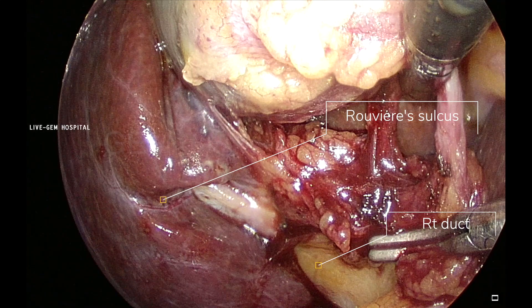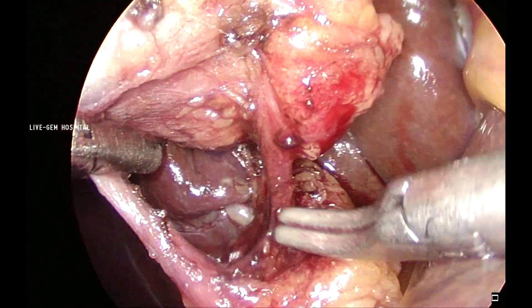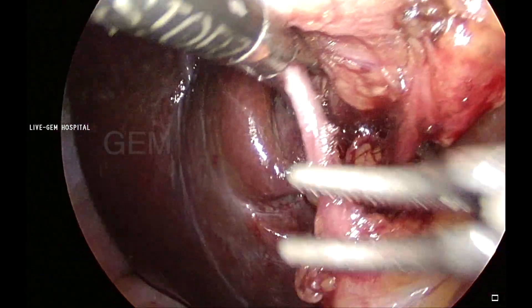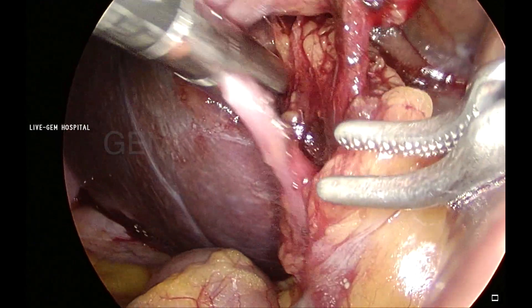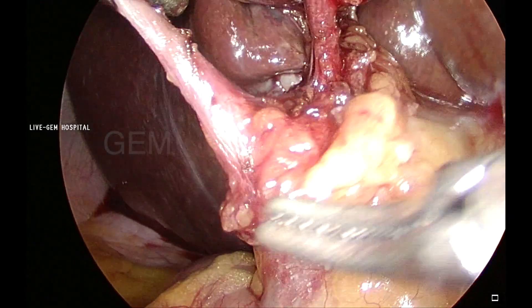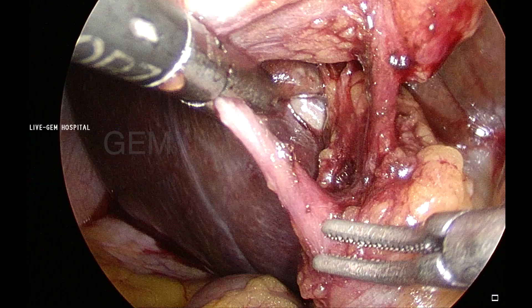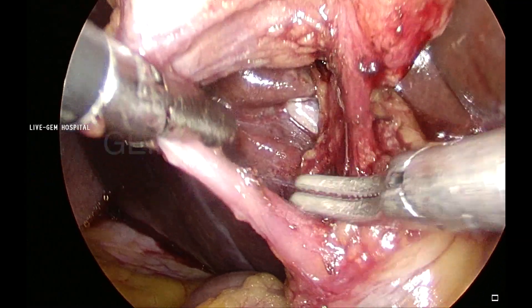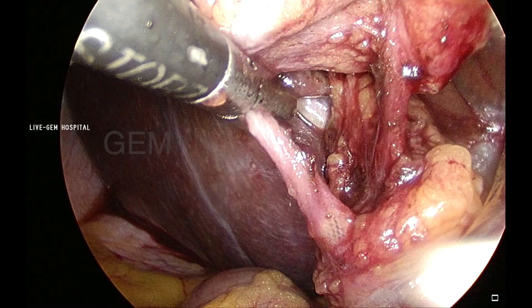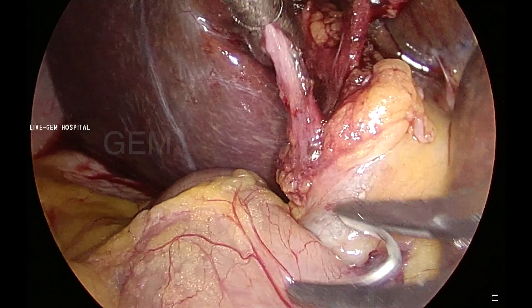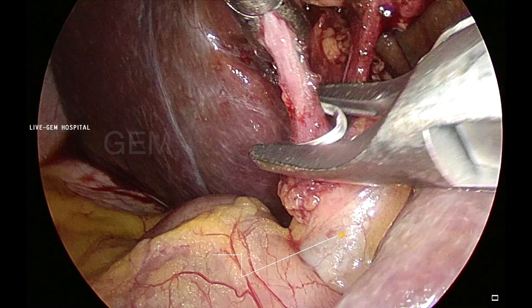Always milking it out — this habit is very important because we are handling the infundibulum and the stone should not pass down. These are the sulcus and the right sectoral duct. Now you can see I am coming up to the level of the infundibulum — the cystic duct-CBD junction — and I am just checking whether there is tenting of the CBD or not. There is a little bit of tenting seen now when I give traction. So I am not going to apply the clip very much down — I will apply the clip about 2-3mm above the level of the junction.